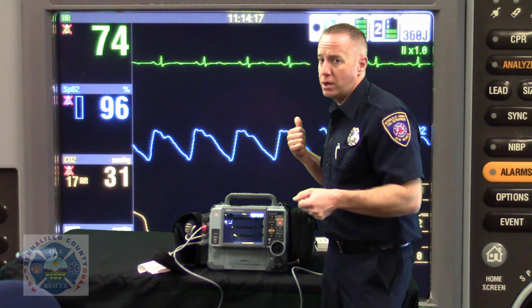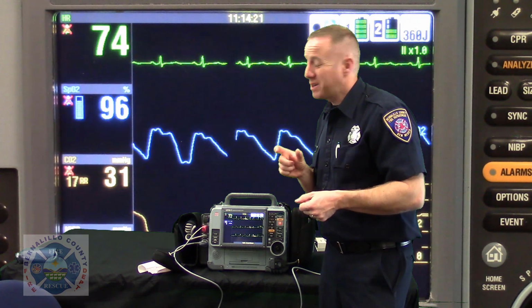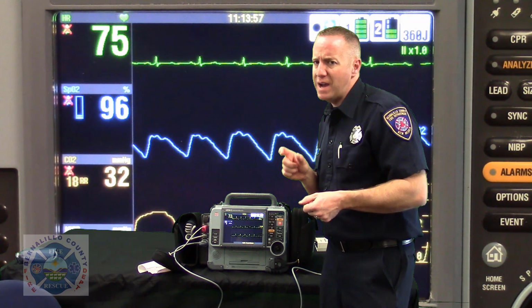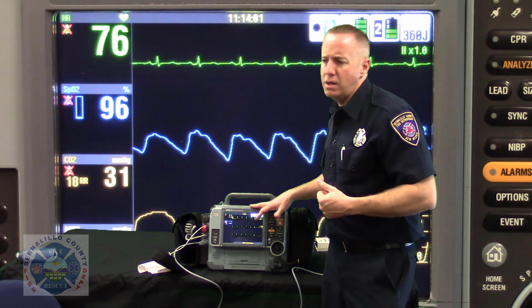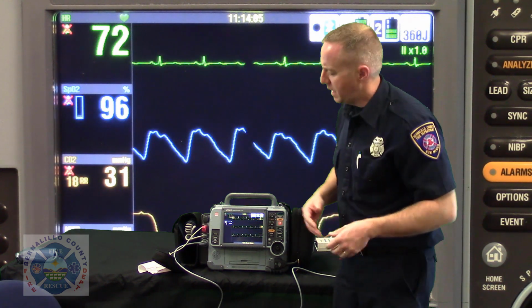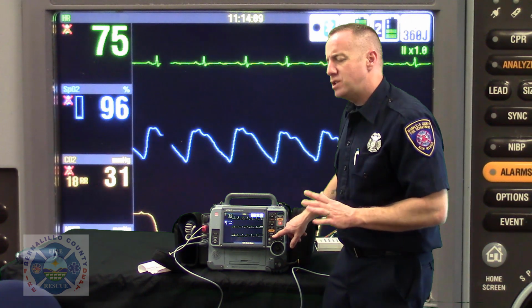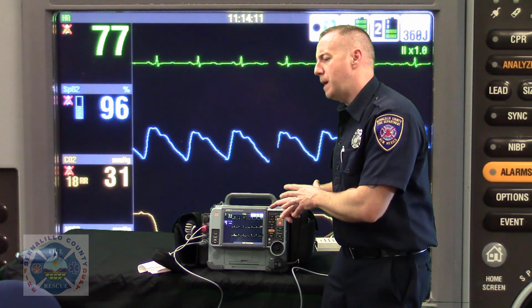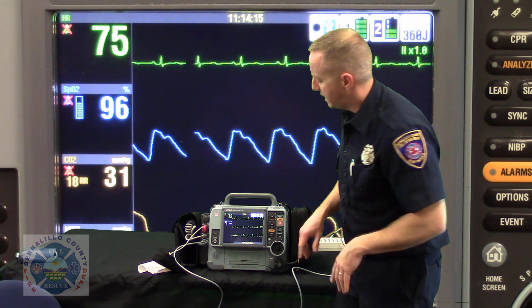a pretty bad acute coronary syndrome, but they don't have their date of birth on here because they're going to see this weird configuration of 5 numbers, and they don't know if that's a number that the monitor's auto-generated or something that the printer plugged in there. How do they know that that's a birth date? The only solution is to make it in such a way that I just tell people, if you were to read this paper and you didn't enter the data, would you know that's a birth date or not? That's the correct answer.